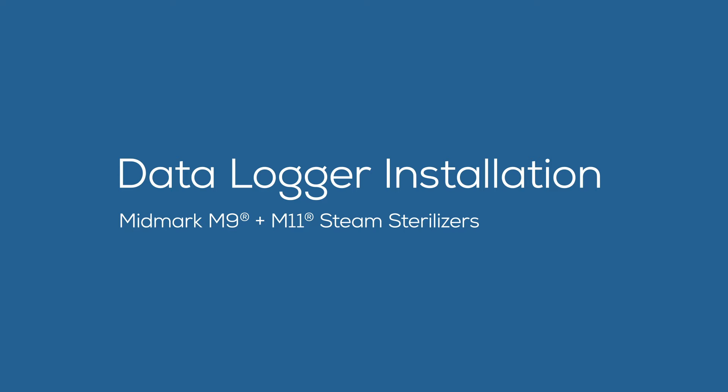This video provides an overview of the installation of the sterilizer data logger accessory into the Midmark M9 and M11 steam sterilizers.